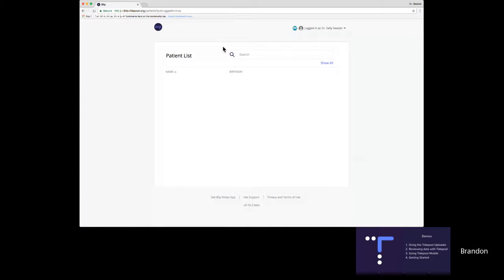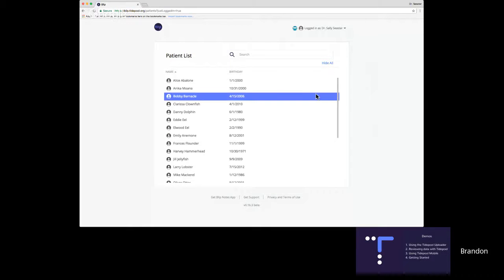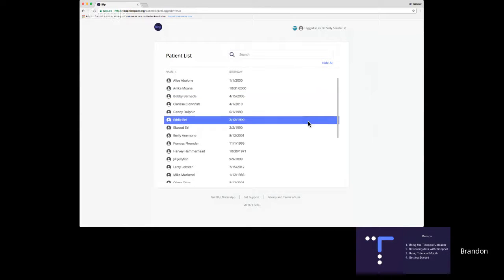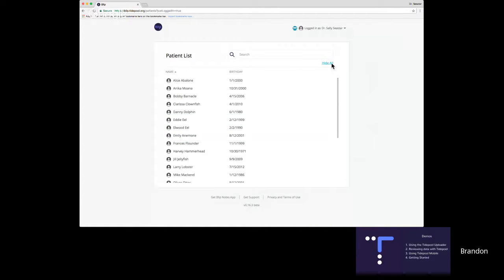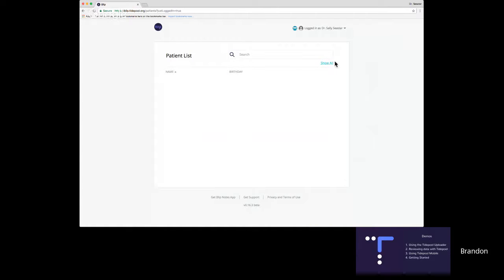When you as a clinician log in to Tidepool, this is what you're going to see — an empty list. It's empty because in case your patient is looking at this list with you, we didn't want to expose everybody's name in your clinic. If you are looking at this by yourself, you can click Show All to see everybody in your clinic. But if you're sitting there with a patient, let's search for Jill Jellyfish.